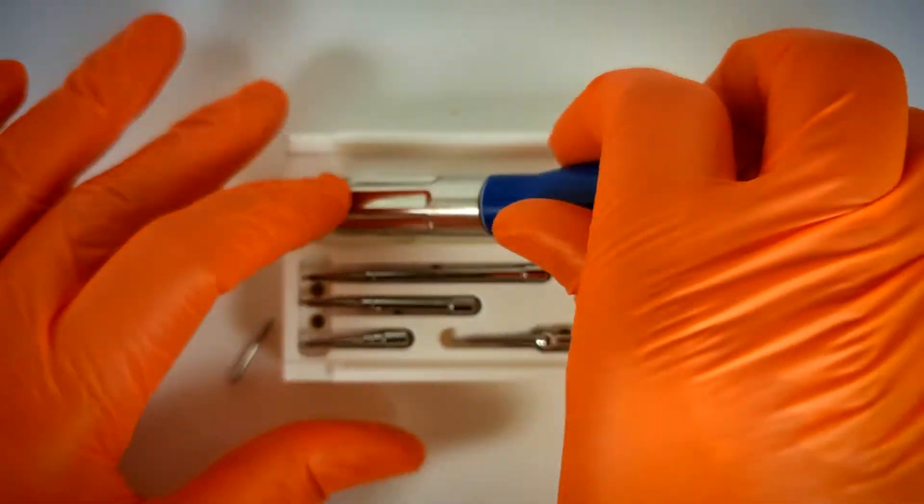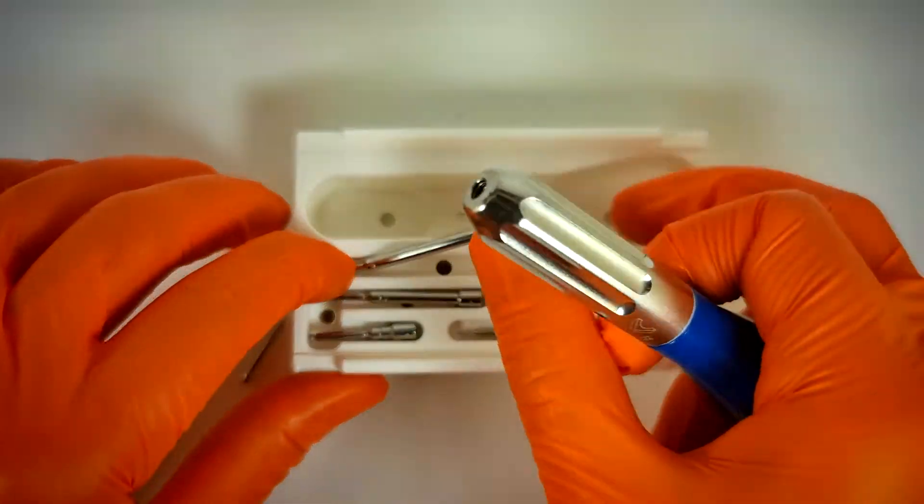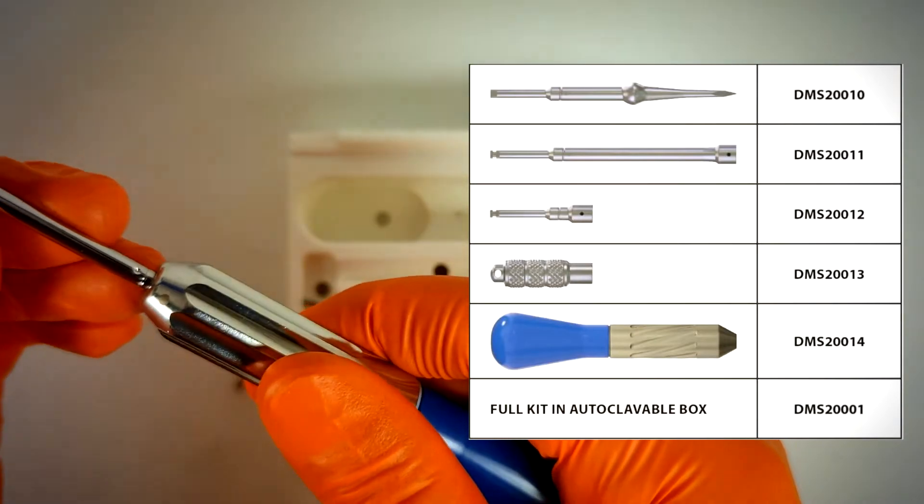Only a few tools are needed to operate the TADS. They are easily available for reorder and compatible with other systems in the market, allowing for as easy a practice transition as possible.